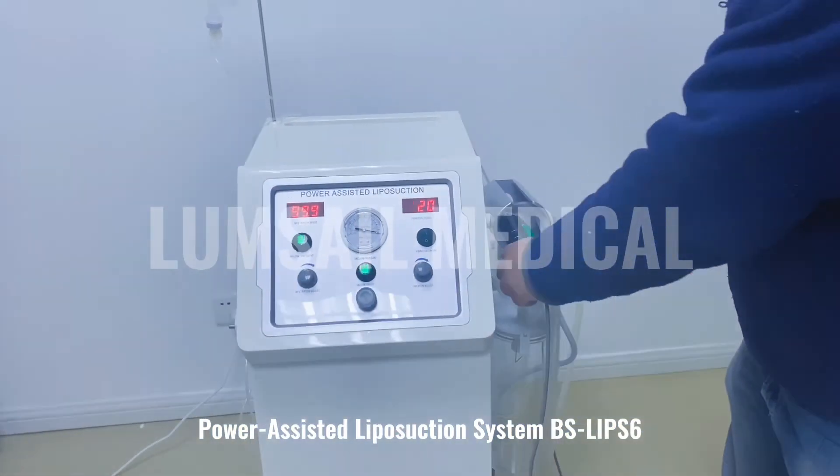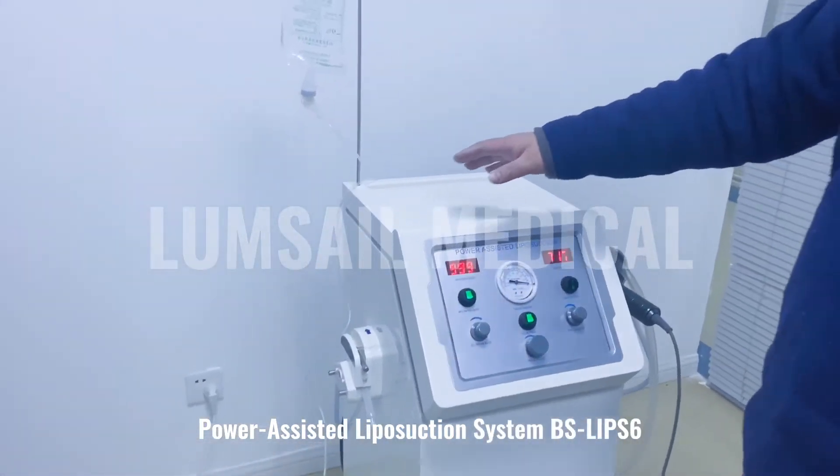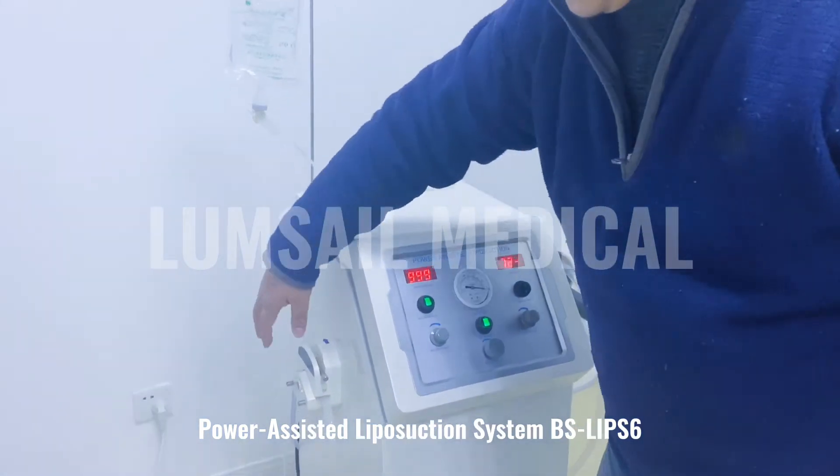The second function is the infusion. Infiltration is an important function of the liposuction surgery. Here is the handle with the saline bag and the infiltration kit, which is connected with the pump.